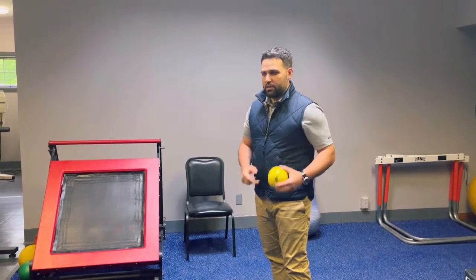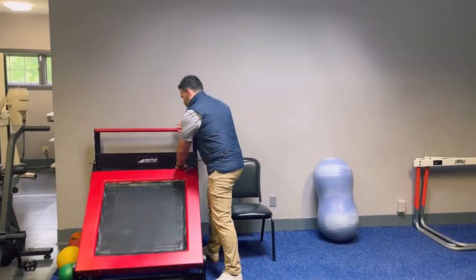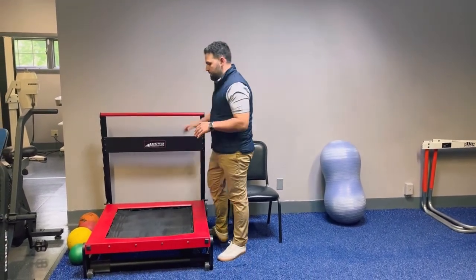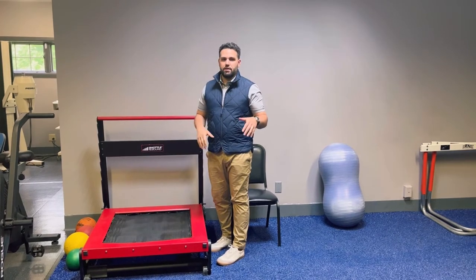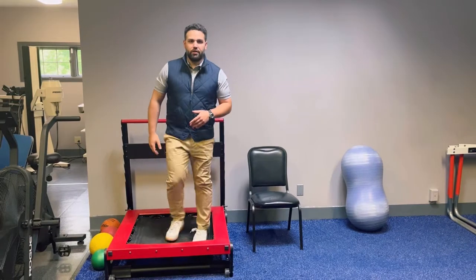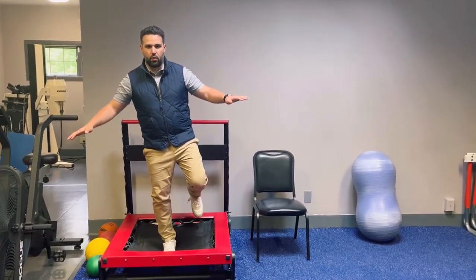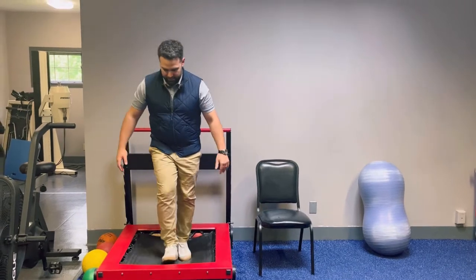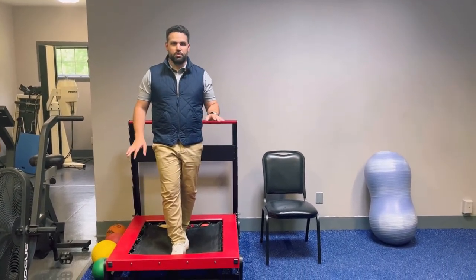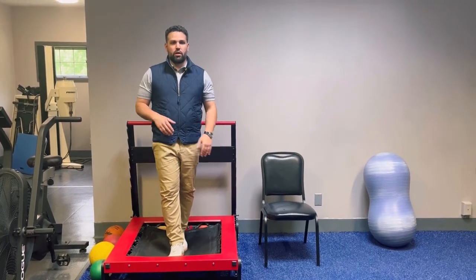We can also change the height of the trampoline. We can lay it flat, and in this position we can do a variety of different activities. One thing I like to use it for is balance training — it's obviously an uneven surface, so you can work on balancing on one leg, do a tandem stance, or have a therapist push on the trampoline to alter the movements and challenge your balance.